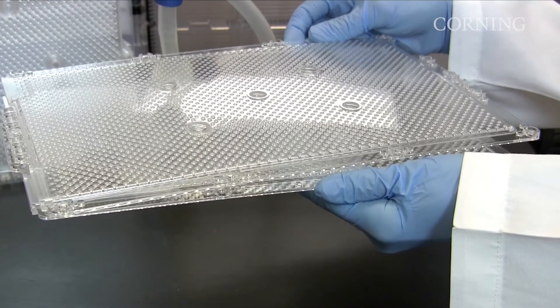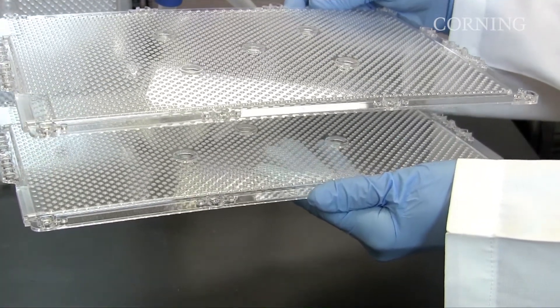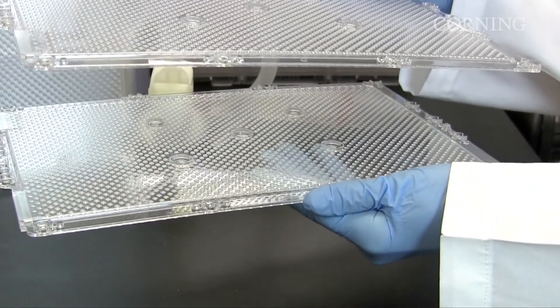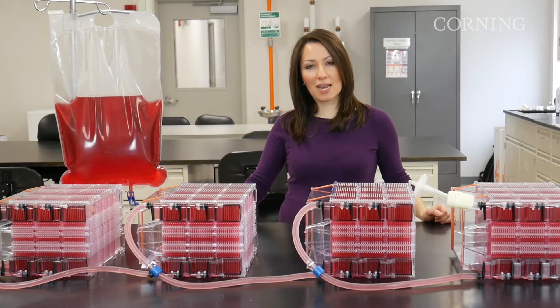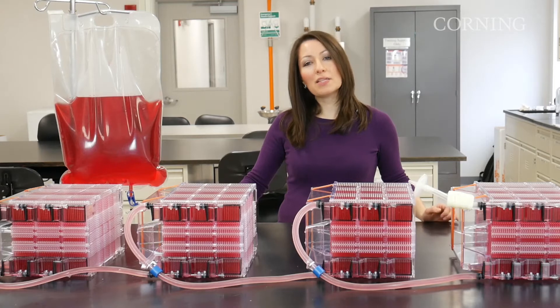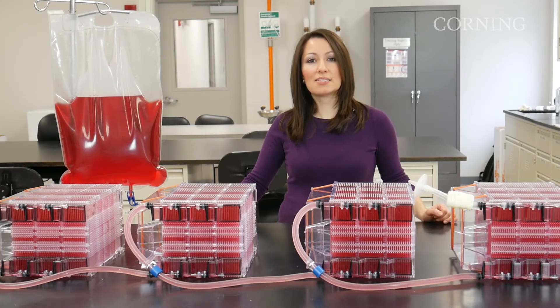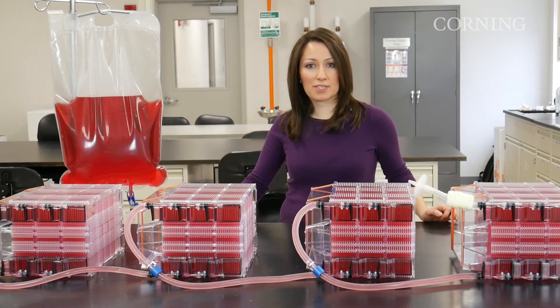The arrangement of layers within the vessel substantially increases cell yields per cubic inch. For those who need significant cell yields, a manifolded setup is best. You can typically grow 2 billion cells in a single 36-layer HyperStack.